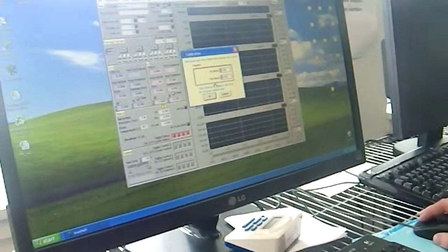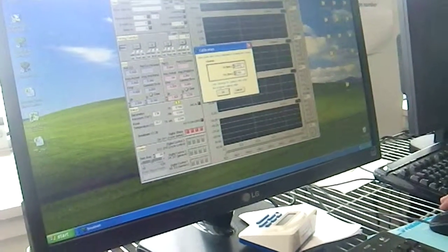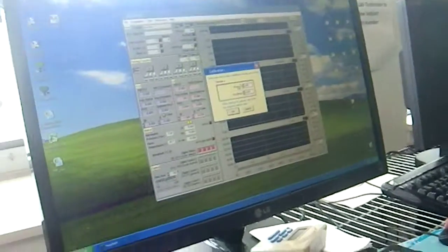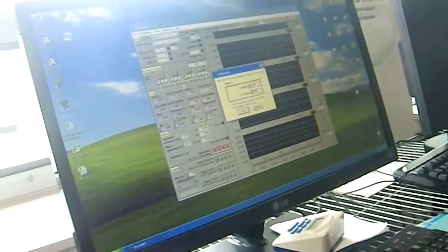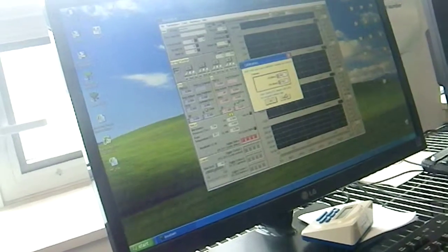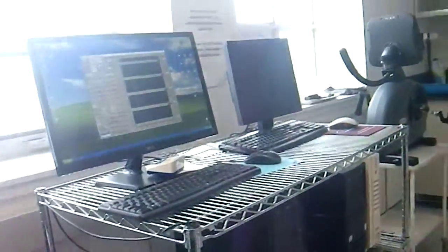So now it's going to measure volume. That syringe is set to 3.003 liters. That's a known volume. So what we're looking at here is the discrepancy between what I'm actually pumping and what the machine is seeing. Then I can put a correction factor on to make sure we get accurate volumes. Is it okay? And then you just go through with the plunger. And you'll see the data come up on the screen.